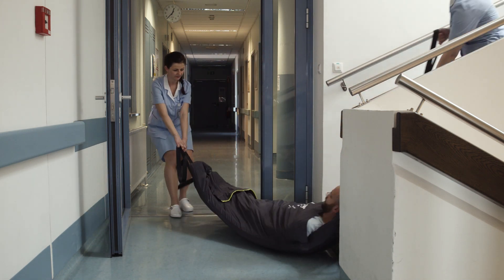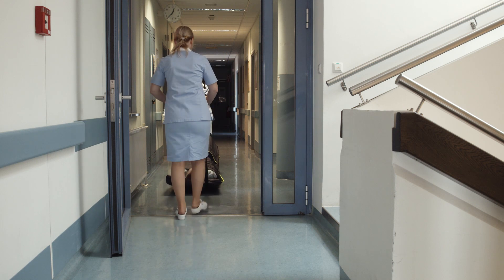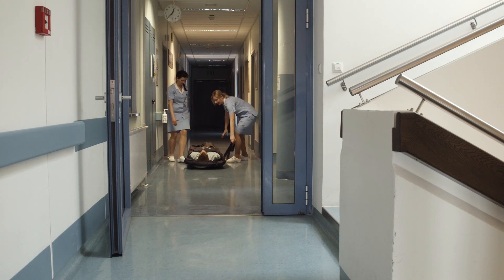If you are not certain about your abilities, ask another person for help or leave the evacuation to others. Your own safety must always come first. Perform regular drills with the evacuation mat and always follow the instructions.